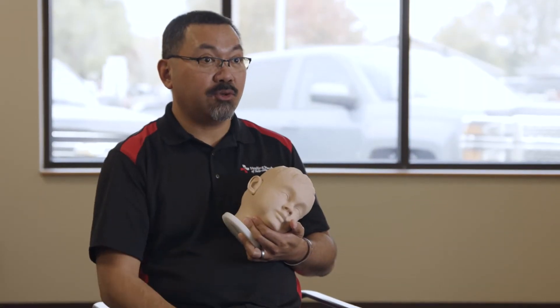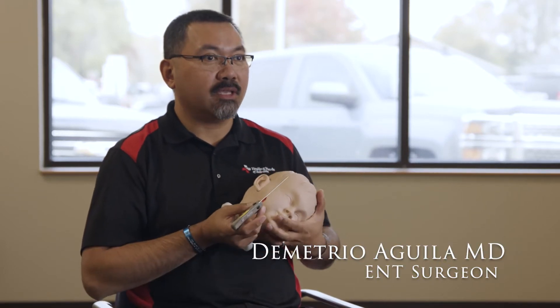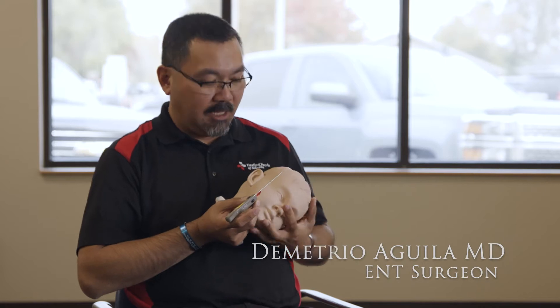So we're going to show you exactly how Tula works with this little model patient that we have here. Obviously I wouldn't hold a kid's head like this, but that's just to make it easier for you to see what's going on.